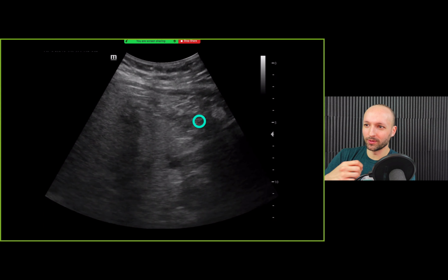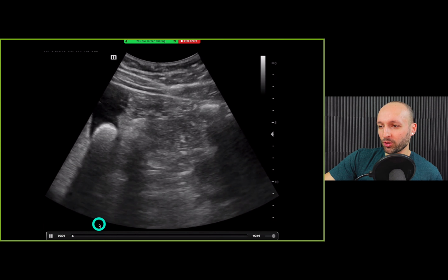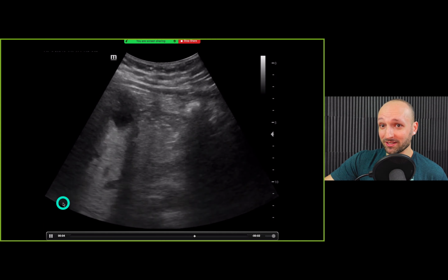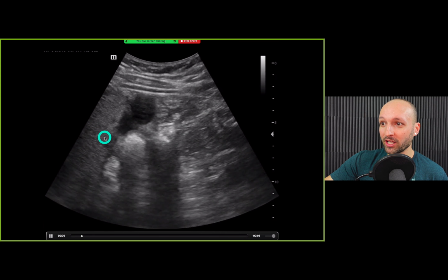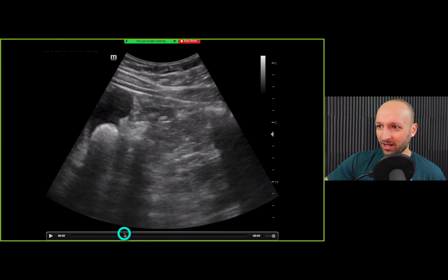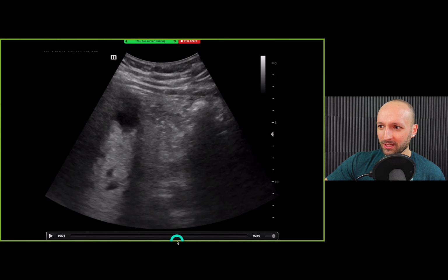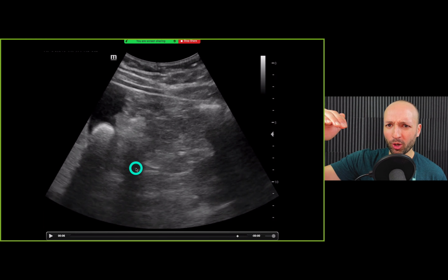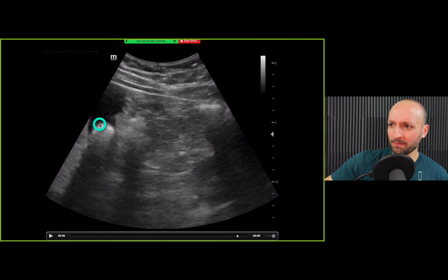Big old stone. Now, if this patient presented with right upper quadrant pain, I would do this ultrasound and basically just call surgery, because this is a very large stone that's impacted in the neck. One thing I wanted to show you is that oftentimes you are going to see a stone that's just a pure hyperechoic rim with massive shadowing underneath it. But with this stone, you can actually see a little bit through it. You can see the whole thing, just not the outer rim.